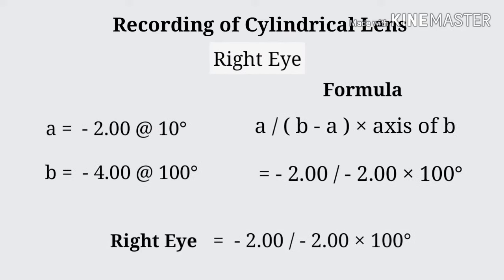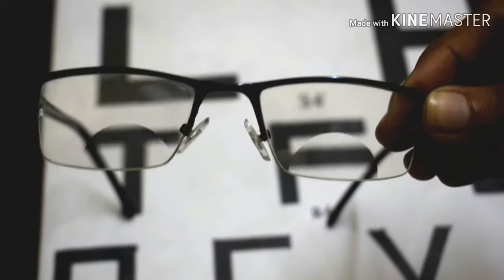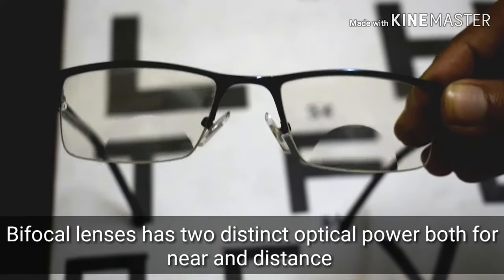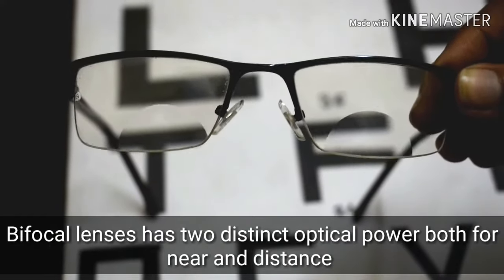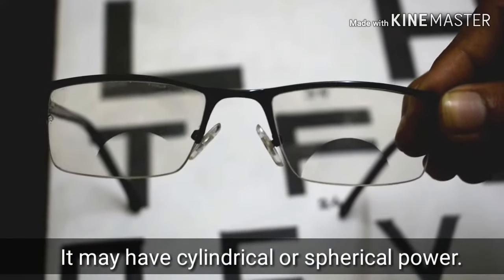Similarly for right eye. How to neutralize bifocal lenses. Bifocal lenses have two distinct optical powers for both near and distance, and may have cylindrical or spherical power.